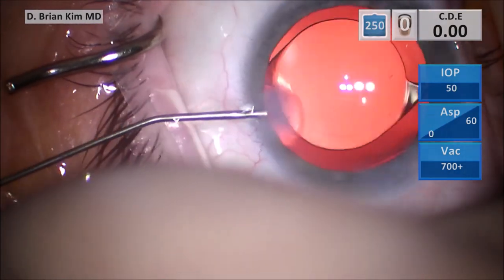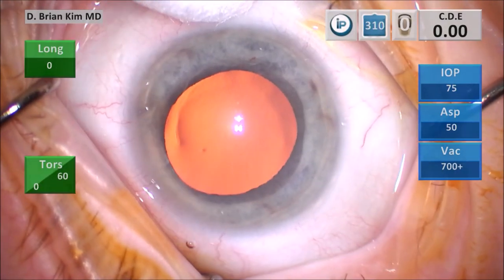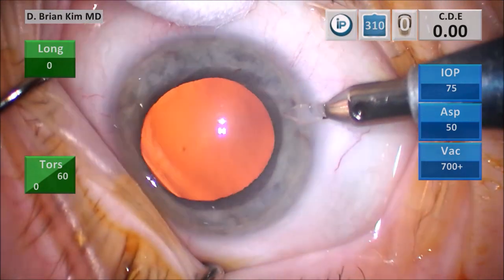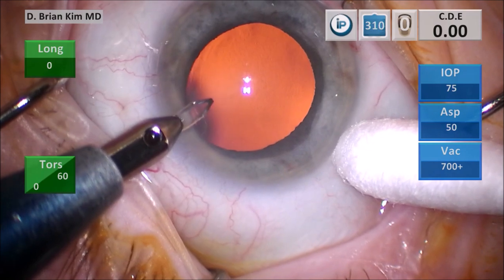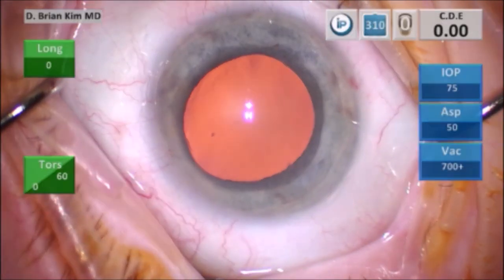Now we'll go over another case step by step. I use a cotton tip to manipulate the eye to provide access so that I can make a nice rectangular paracentesis incision. Sometimes the eye is not cooperative, so you have to use a cotton tip to move the eye over so you can make a flat incision that's parallel to the iris plane.